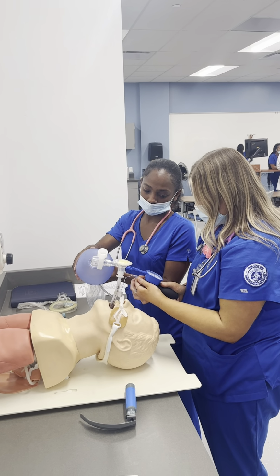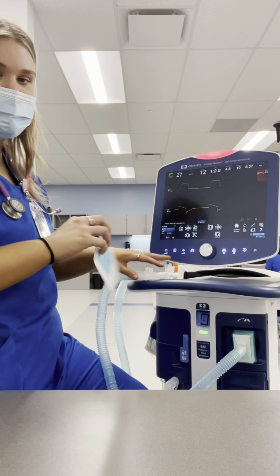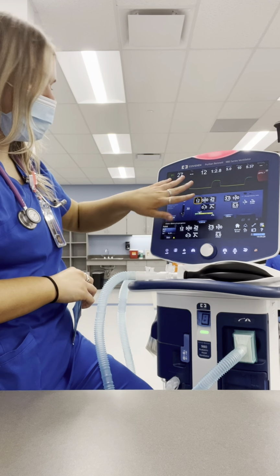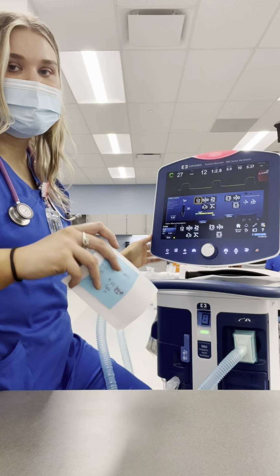Okay, so now that my patient has been intubated, we are putting him on a mechanical ventilator. So I'm using the Puritan Bennett 980 ventilator, and after running the SST, I'm going in to do a new patient and to set my parameters, which I've already done, just to show you again. I have my frequency set at 12, my tidal volume set at 500 because his ideal body weight was 80 kilograms, so we have a range of 400 to 640 milliliters, and we have it set at 500.